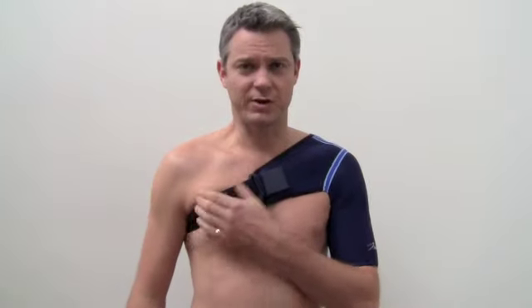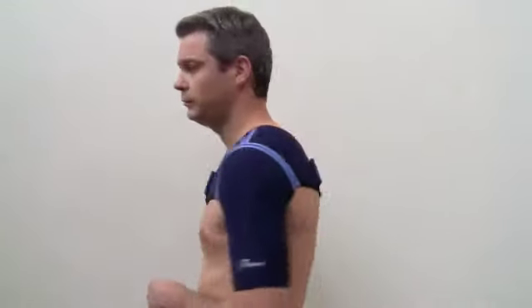This shoulder support is simply velcro and you can adjust that as you deem necessary. And that's it — that is the DeRoyal Pro Shoulder Support. It's in stock and available now on Optimo.com.au.